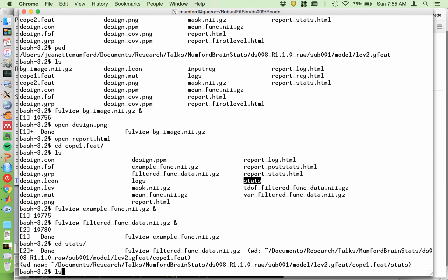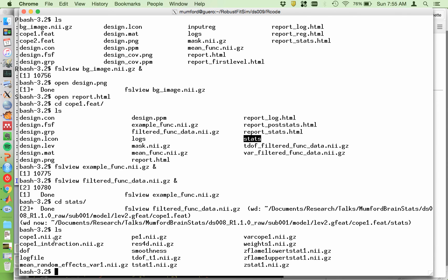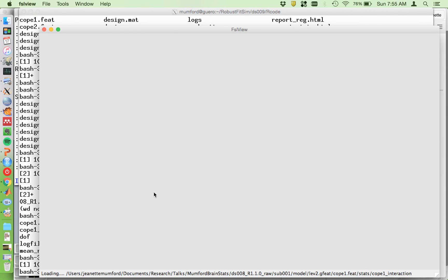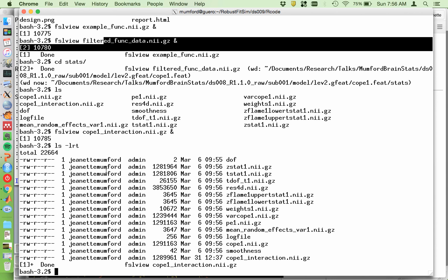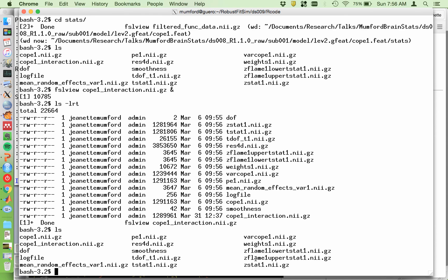There's a stats directory that has the same files in it as the other levels. I only ran one contrast, so here's the parameter estimate — the cope for it. And then the rest: you have your Z statistic, your T, degrees of freedom image, T stat image, the smoothness, all that good stuff, and the residual image. That's it — it's really not a lot to look at here.